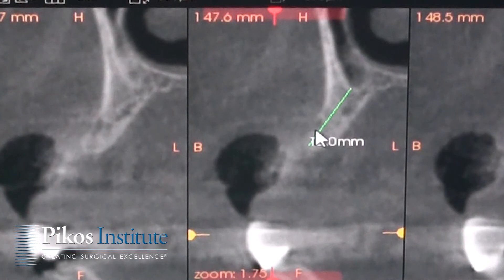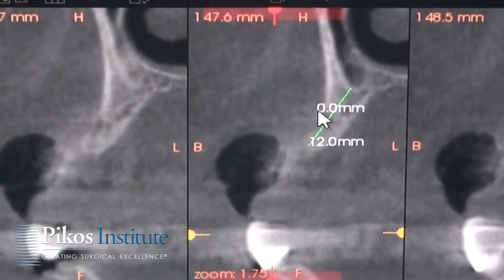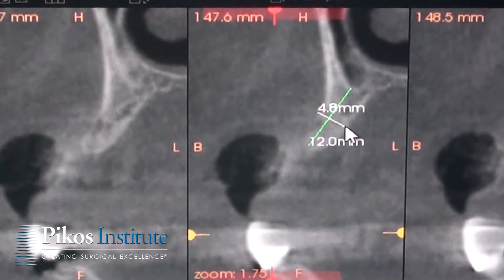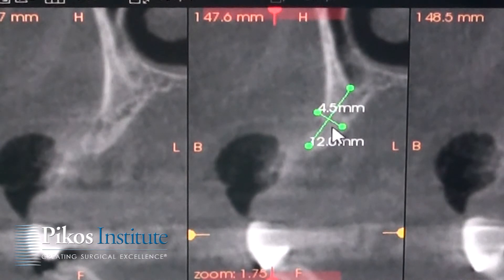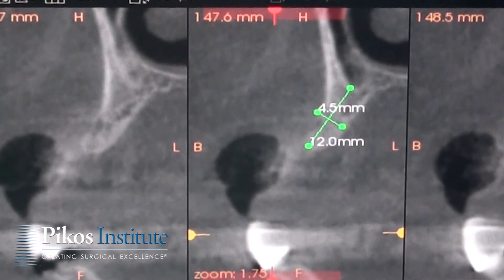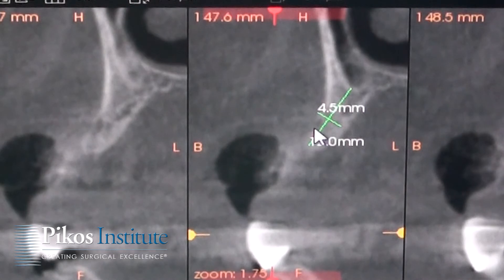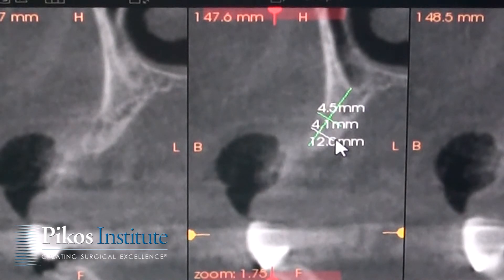Width is the concern. We're looking at approximately 4.5 millimeters roughly at the largest area of width in this section. It's a little bit less than that if we're more to the crest — probably 3.5 millimeters or thereabouts.